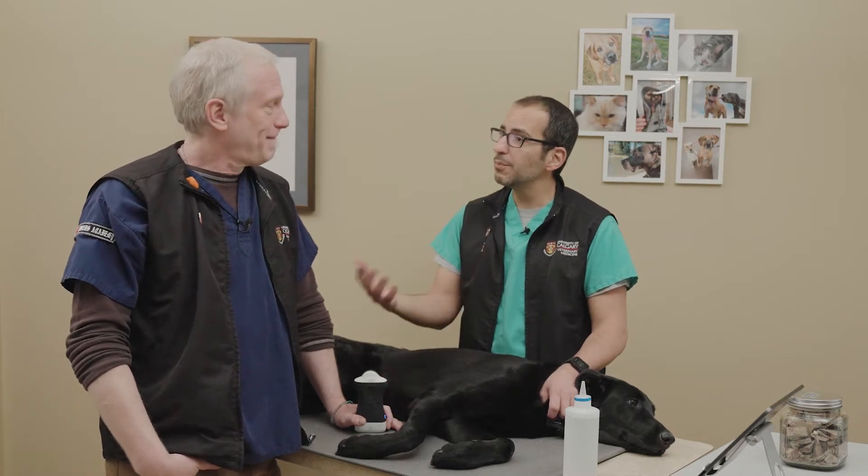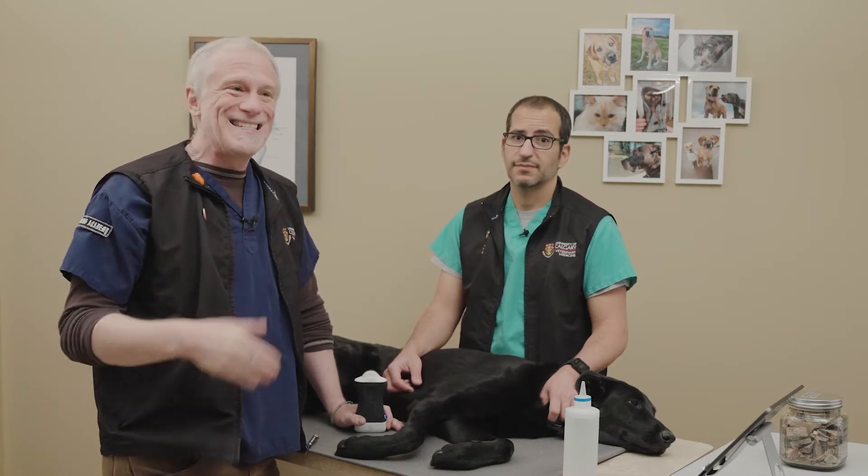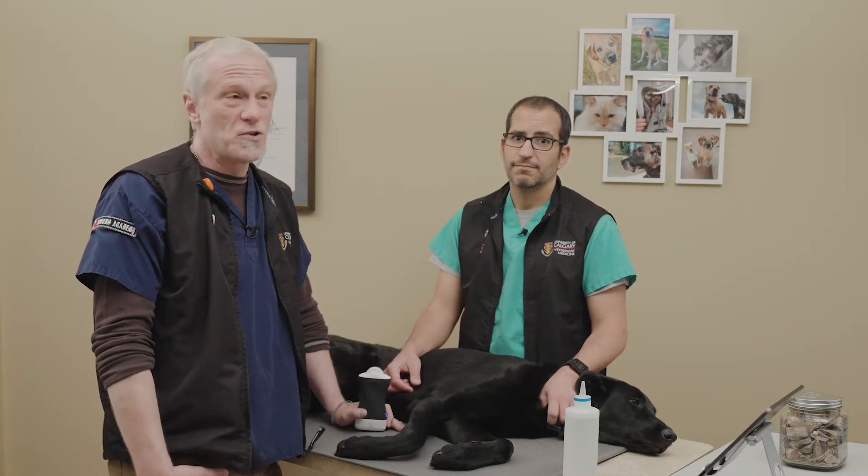So tell me more about that. This is something that evolved from the FAST scan that we published in 2004, looking for free fluid in the abdomen of dogs suffering from trauma. We've come a long way from that original FAST scan, and we're now looking for a lot of other pathologies. That's why we've changed the name to point-of-care ultrasound — it includes a lot more than fluid. This is our five-point abdominal point-of-care ultrasound, or five-point APOCUS exam.